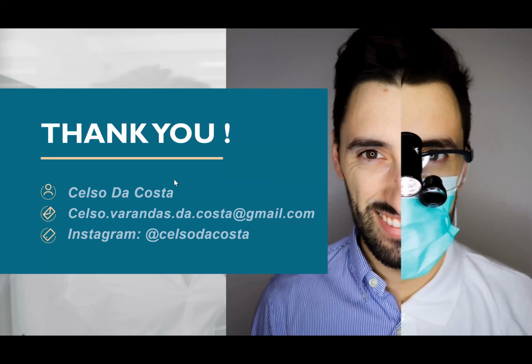Okay. What about the white spots? The million-dollar question. Yeah, that is quite hard. It's unpredictable with white spots. Sometimes they are completely camouflaged with the rest of the enamel. Other times they are a little whiter, but that lasts 1 day. After that, with the saliva and everything, in my experience with my patients, they disappear. But if we have really big white spots, normally I apply the product around them and not directly on the white spots, just to camouflage them at the end of the treatment.